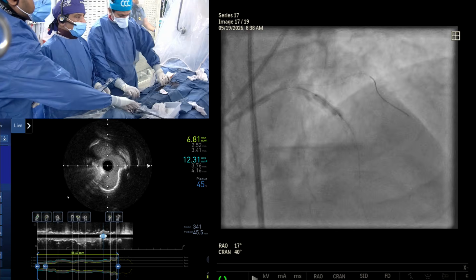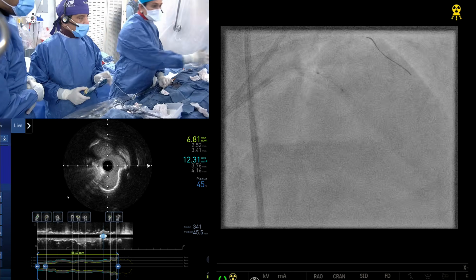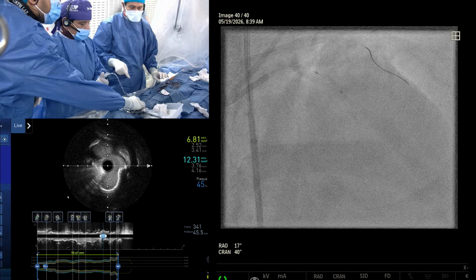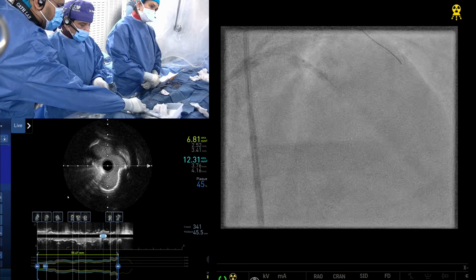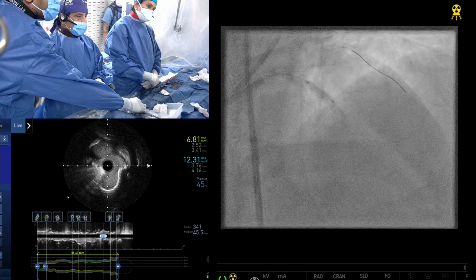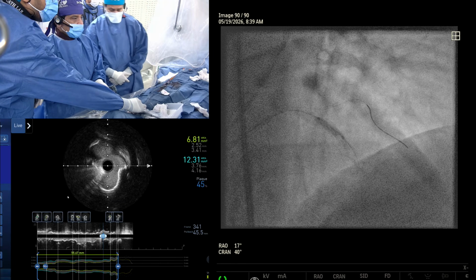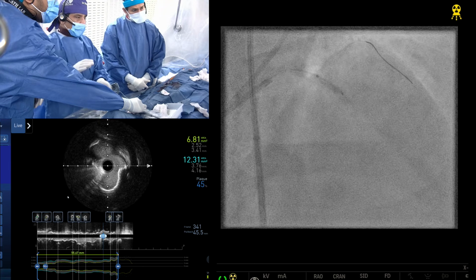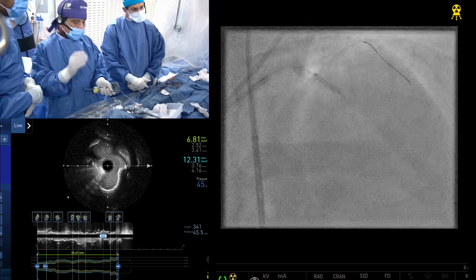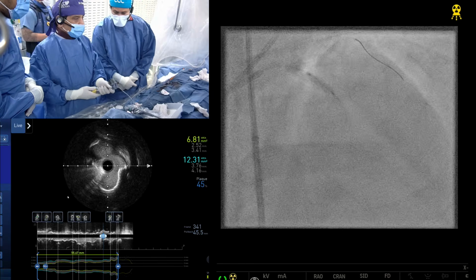All the data have shown, all the randomized trials comparing rotational atherectomy with IVL, they have shown similar efficacy, similar procedural success, similar MSA, except a lower perforation rate with the IVL compared to rotational atherectomy. But IVL is inferior, particularly in calcified nodule lesions, which has been shown in a few trials.